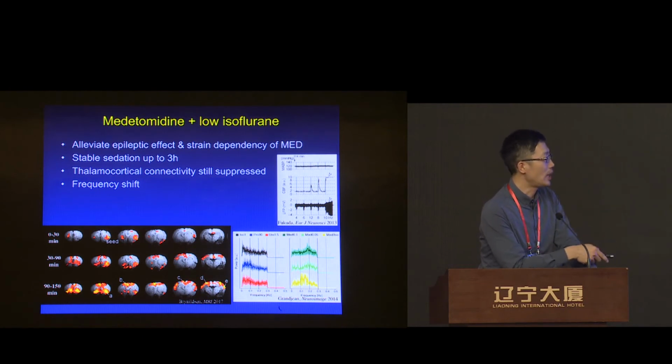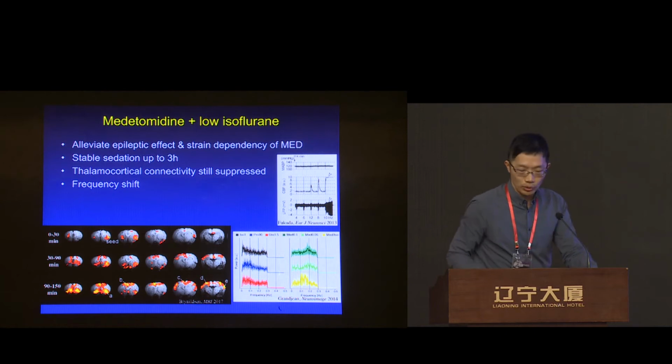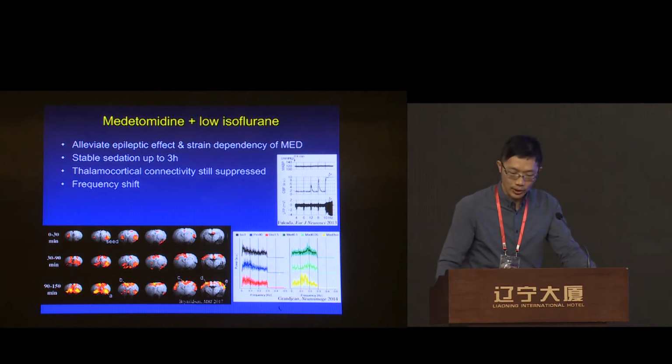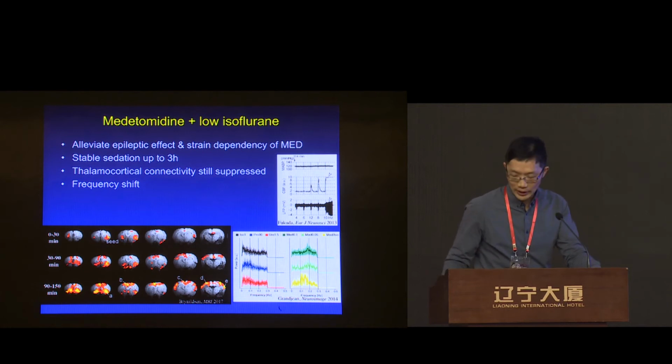In this paper, they show that when you have medetomidine, your response could shift to around 0.2 Hz. So you have to be careful not to set your cutoff frequency too low.